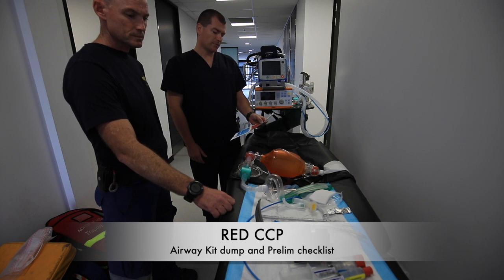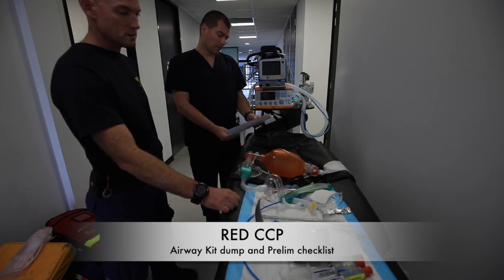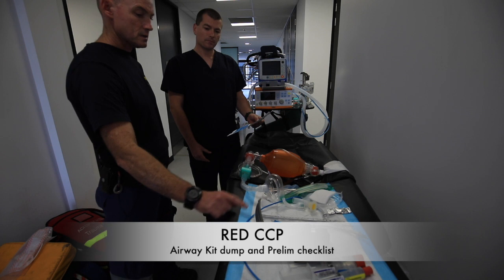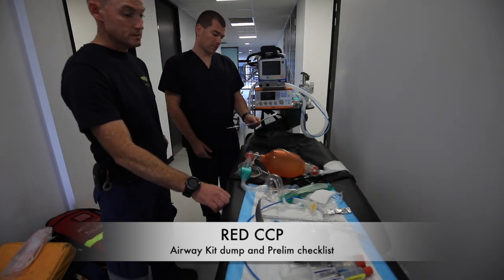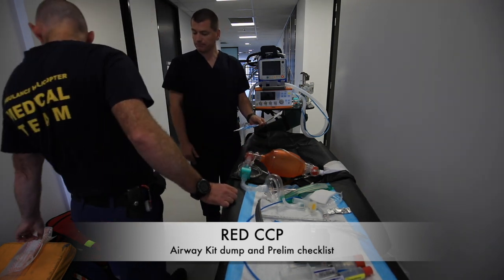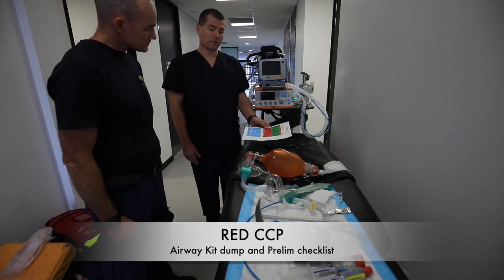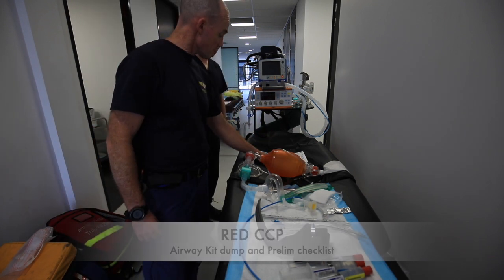Tube checked and lubed — check. Syringe, tube tie — check. Bougie chosen, shaped, and gauze available — check. Forceps — check. Eye gel for the hot zone — check. Cric set staying in the cold zone, left out on top of the yellow kit — check. Green check is complete. We'll PPE up now.